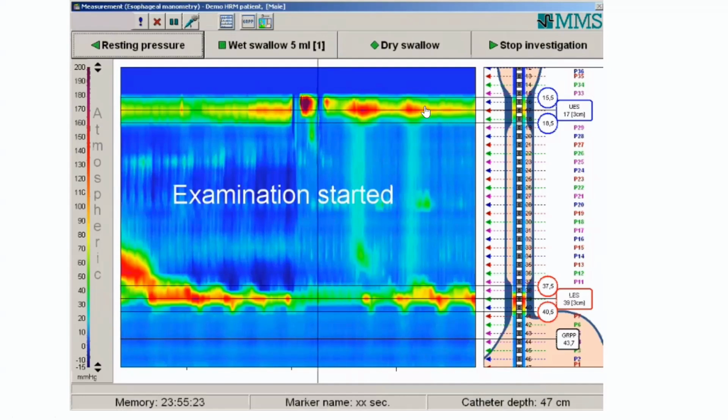When the patient takes a deep breath, the pressure in the esophagus will decrease, and the pressure here in the LES and in the stomach will increase. I have to ask the patient to do the deep breath 3 times to make sure that the catheters passed to the stomach. I will share, inshallah, next time some slides showing how it will look when the patient takes a deep breath. When we discuss some real cases, we will see how it will be very clear.